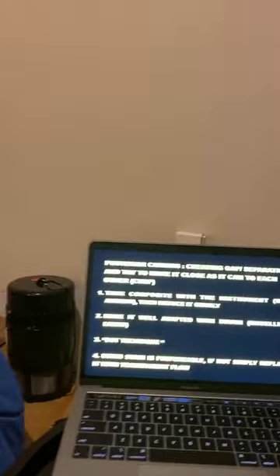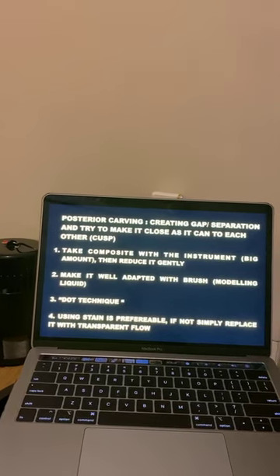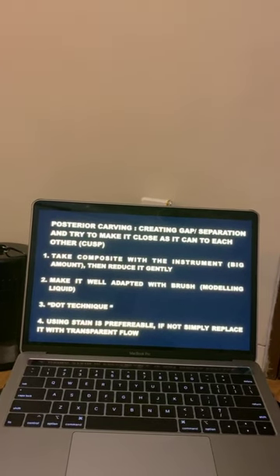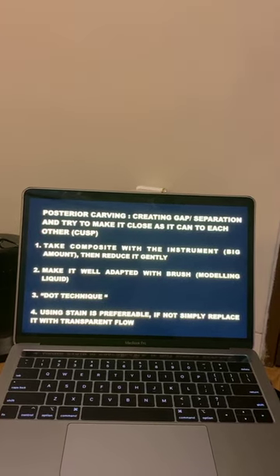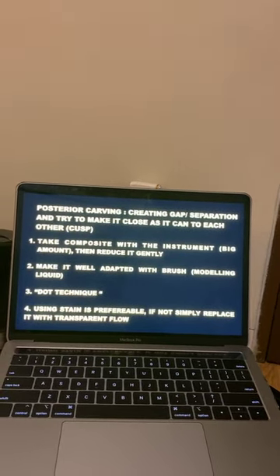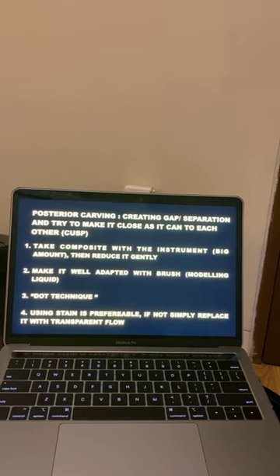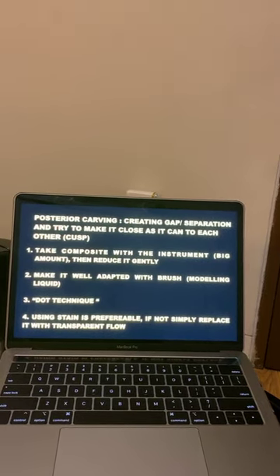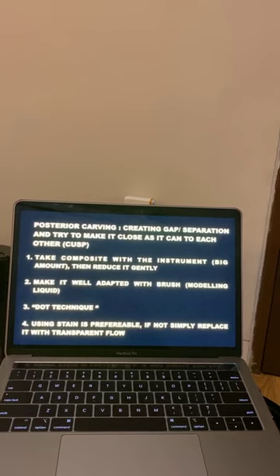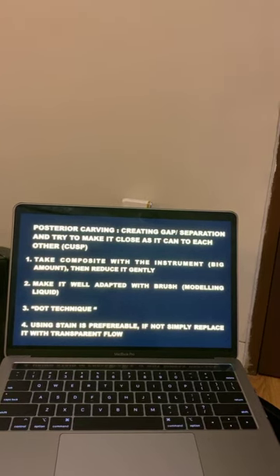Wow, I received so many questions here. Okay, how do you make sure your patient is centric, correct occlusion of the patient? How do you make sure? What are the high points? When to check the high points? Please save this live. Composite brand? Are you using an iPhone for recording? Yes. Do you polish with or without water? Without water. What instrument do you use to carve the dot? I already said about that, this is my custom instrument. Do you use SDR or a different material for the first step? Yes, I often use flowable.